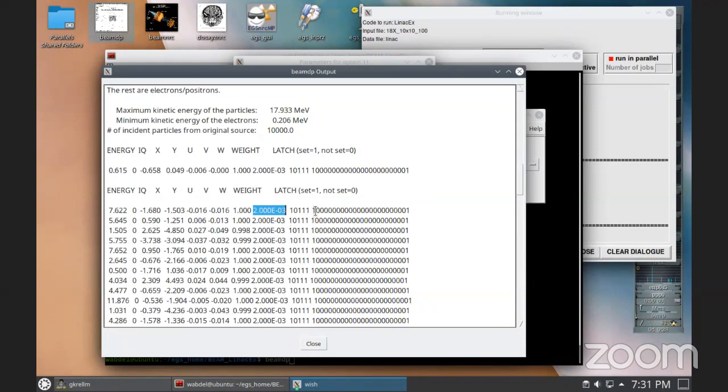I think there are 16 bits for a particle. So these are switches, imagine zero or one. When we do the simulation, we can say, if a particle interacts in the positive X jaw, for example, I want you to latch bit number 9. So you give it 1, okay? If it interacted in a certain region, I can latch another bit. It doesn't make sense to latch the same bit for two completely different regions. So you would say, bit number 12, please latch it in that region.